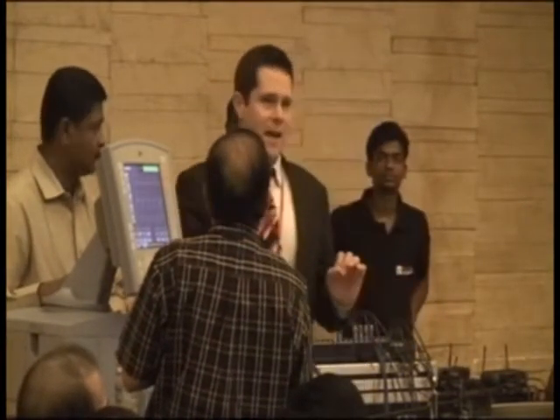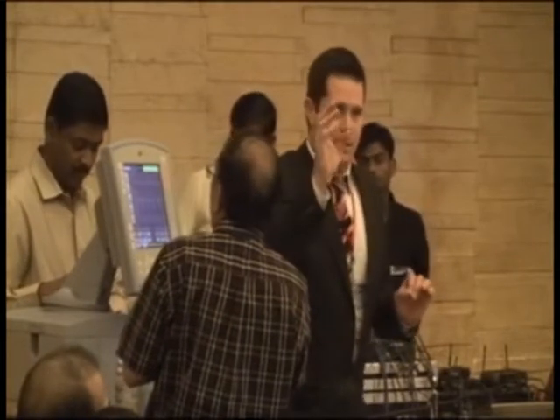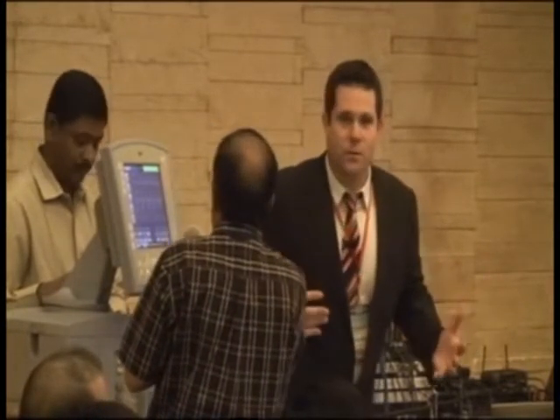We're going to wait for that in just a minute, okay? I would increase the peak too, but I talked for an hour this morning about certain things that you give to patients that are on a mechanical ventilator. What are some things that we can provide to the patient that's mechanically ventilated? Aerosols? We're humidified, very good.